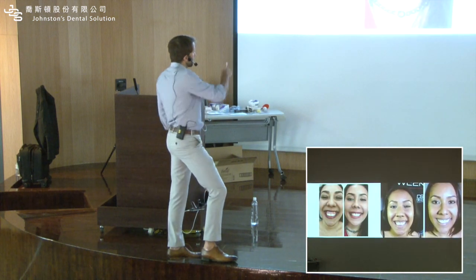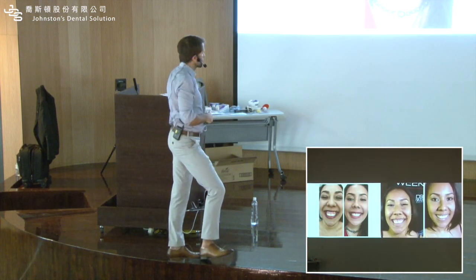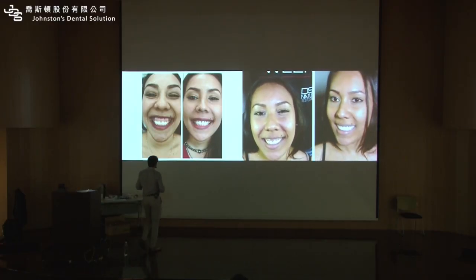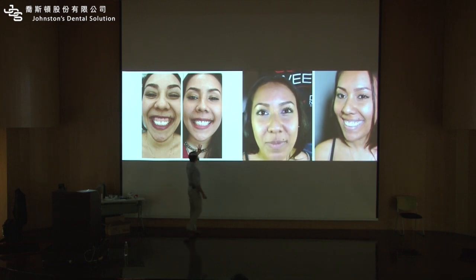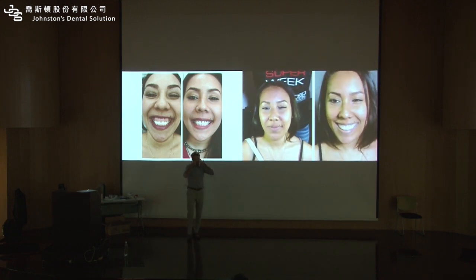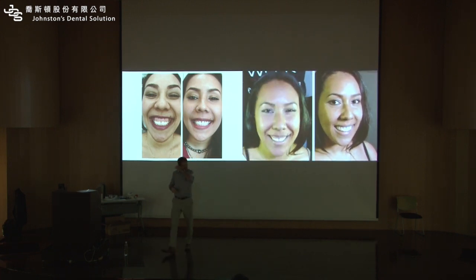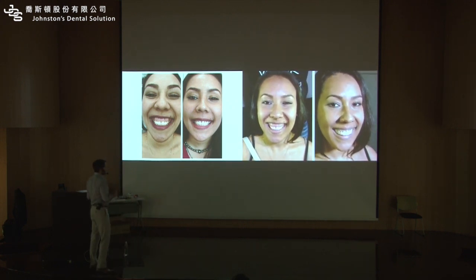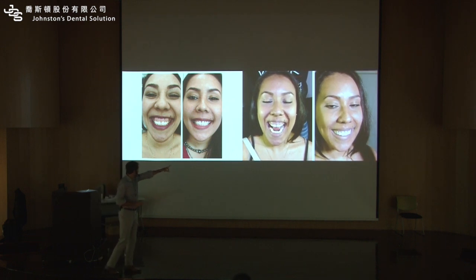So this is back to the other patient. This is her surgery after crown lengthening. So she did here crown lengthening and Botox, holding the lip, and she was happy. Okay? But everything because of that mock-up. Okay?